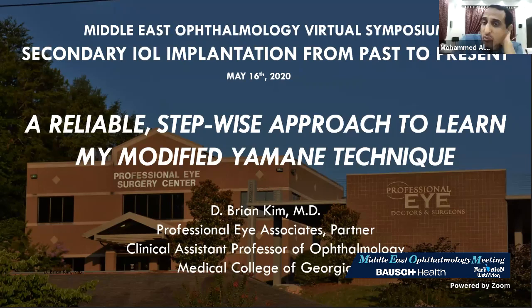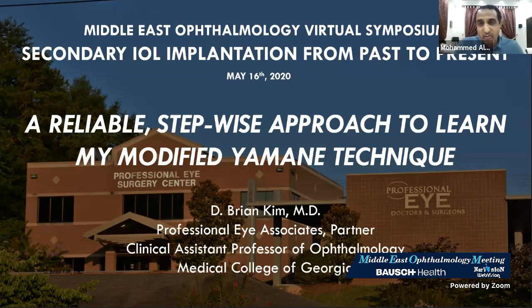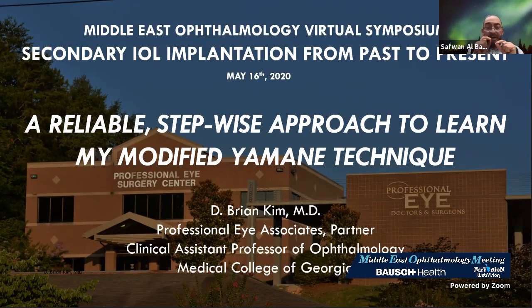Anyway, Dr. Kim, how do you decide how much to cauterize? Just a small amount to create a small bulb. You just want to prevent the haptic from going through the sclera. It's about 1 to 1.5 millimeters. If you need to measure it to create a hinge, it's around 1 to 1.5 millimeters. I measure it and put a mark for it. So the hinge between 1 and 1.5 millimeters will be resistant to the sclerotomy tunnel.